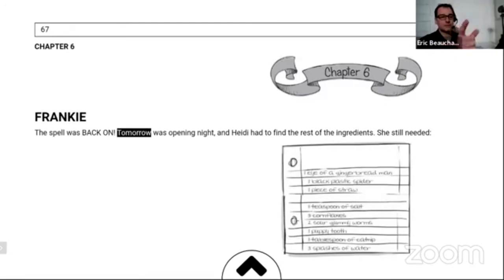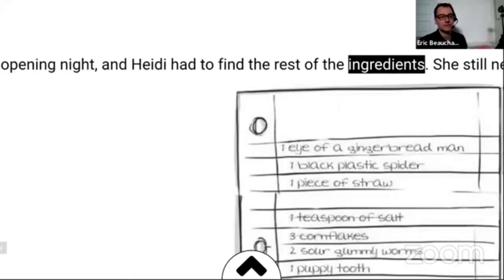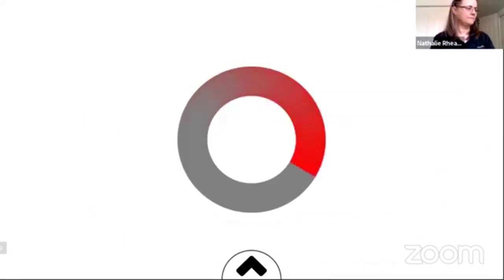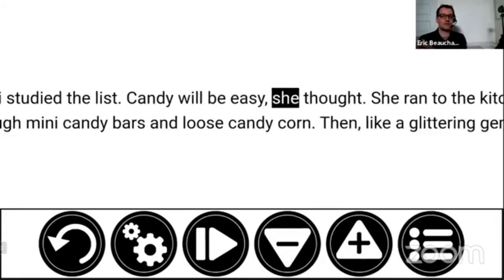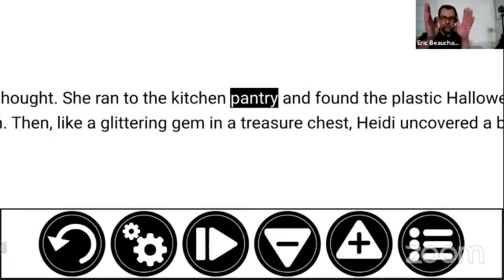You can pinch on the screen to zoom in, and you're going to see the text going bigger, the image going bigger. So that's in page mode. Now, the disadvantage I find in page mode is that you're going to go from left to right all the time. But when you have it in column, it's going to stick at the right width and it's just going to go up and down.